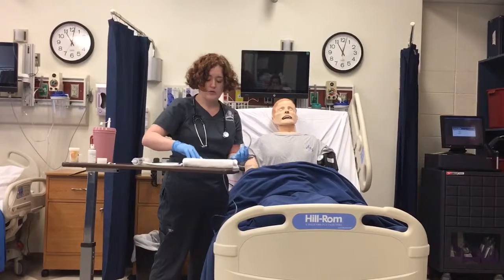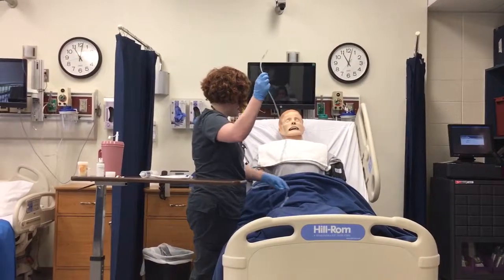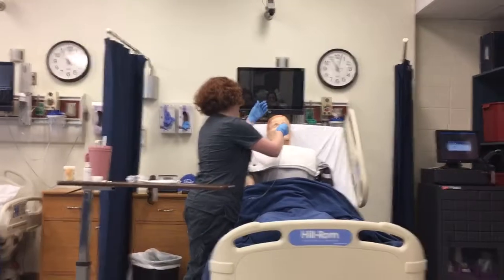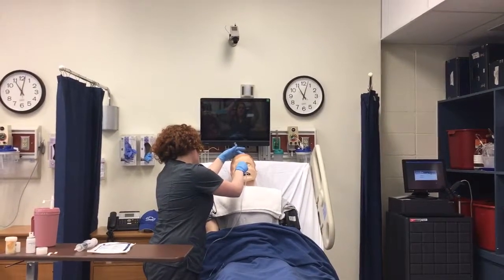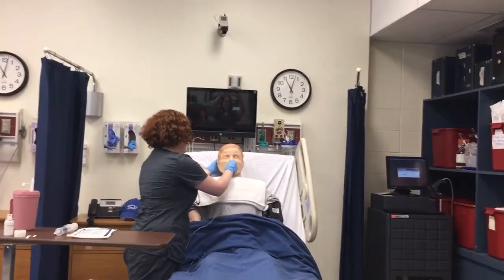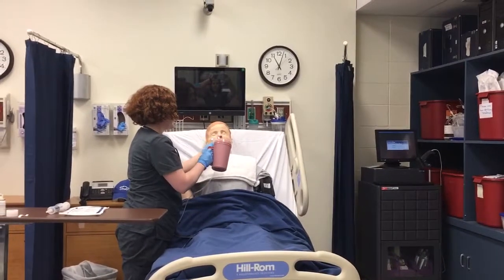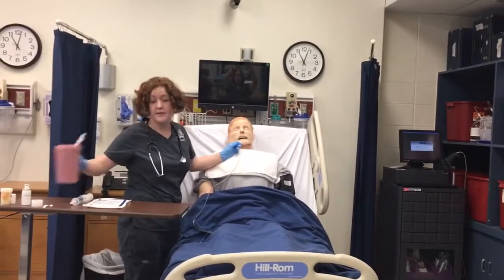I'm going to place a towel over the patient's chest just in case any kind of residue or anything comes out. For the procedure, I'm going to have the client hyperextend their neck. I'm going to insert the tube along the floor of the nasal cavity with the tip pointing downwards, and I'm going to insert until I reach the oropharynx. Then I'm going to have the client tilt their head back down, and then I'm going to offer sips of water and insert two to four inches until I reach the stomach — until I reach my marker.